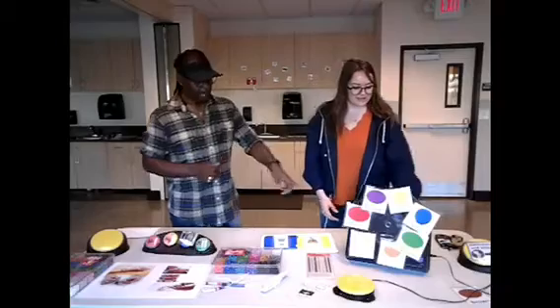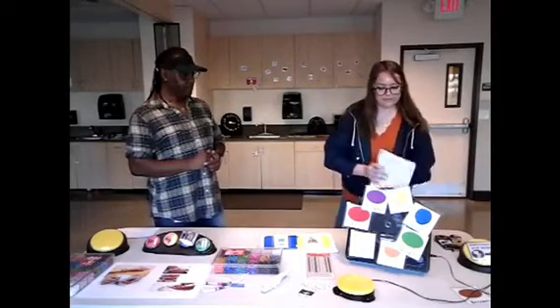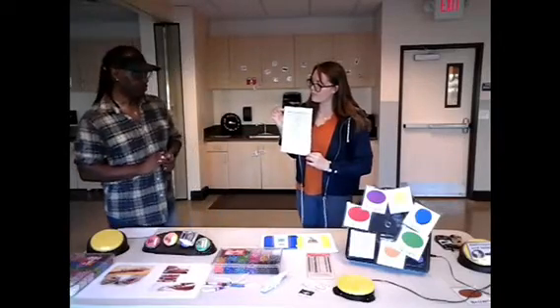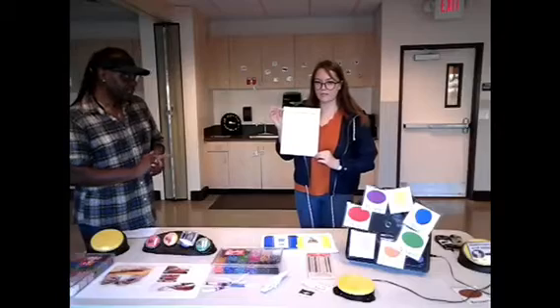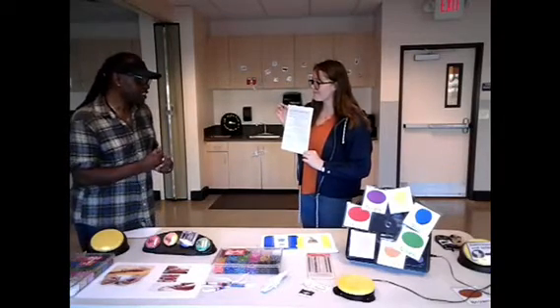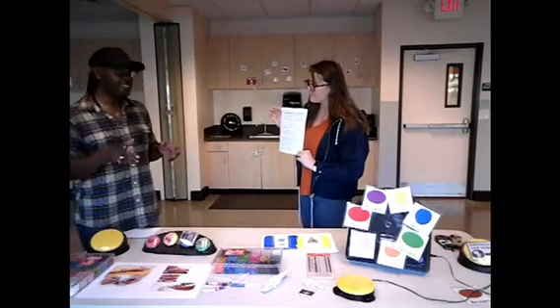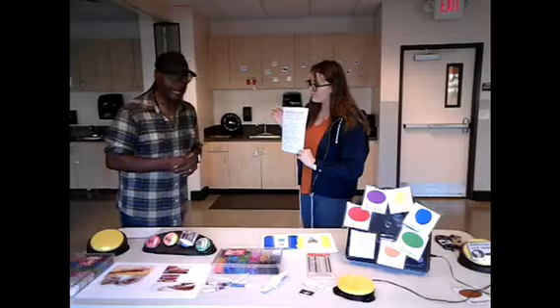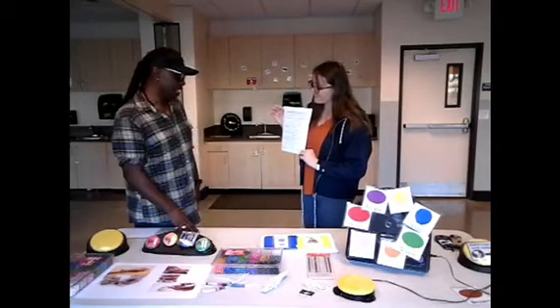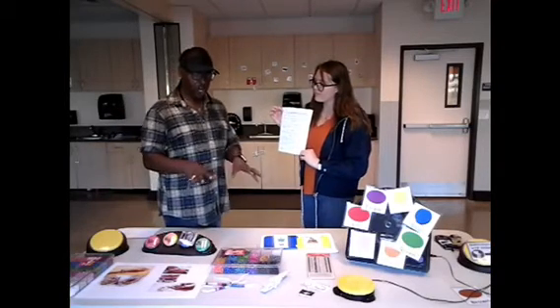Let's talk about some of these communication devices. Hold that up, Cassidy. Go to that first one there. Some of the things you want to do when you're interacting with the consumers, while you're communicating with people with disabilities: speak with respect, pay attention to nonverbal signs, ask questions about nonverbal signs, use good eye contact, talk directly to the person, not about them, and give them time to process what you're talking about.